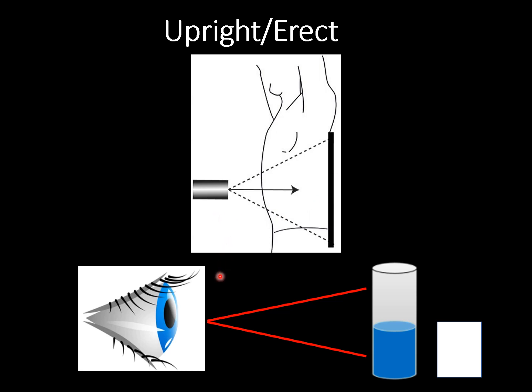If we look at the radiographic features that this produces, any fluid is going to follow gravity and settle dependently. This cylinder is an analogy for the patient's bowel. So if you have fluid settling dependently with gravity, you have air going antidependently, and we look at how this projects onto our film.